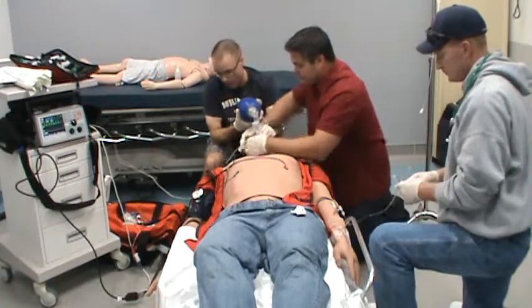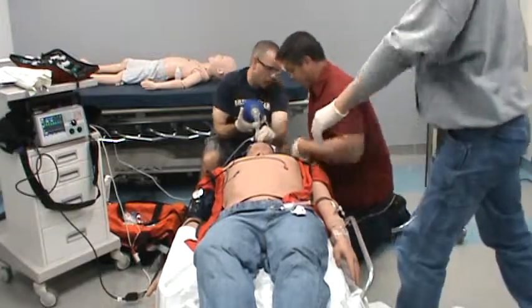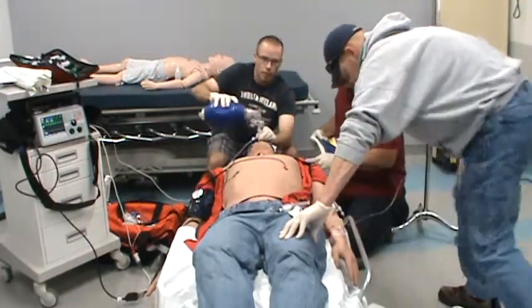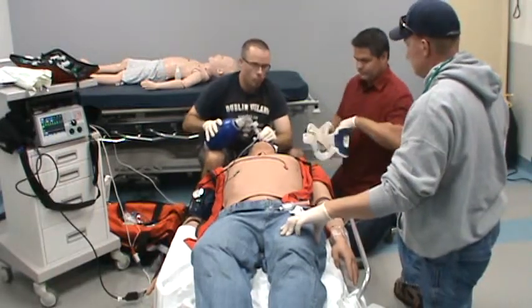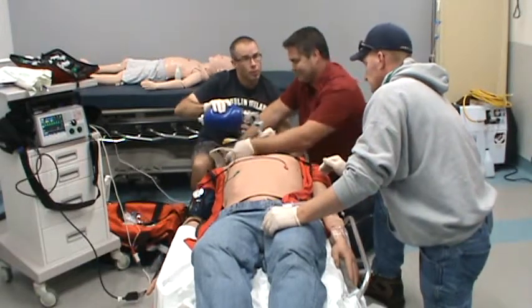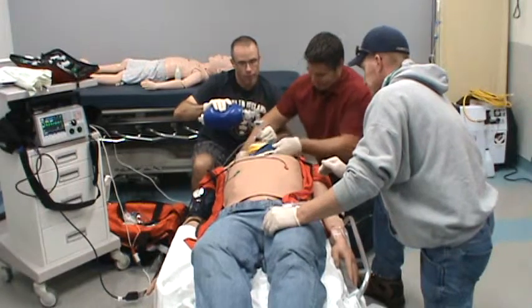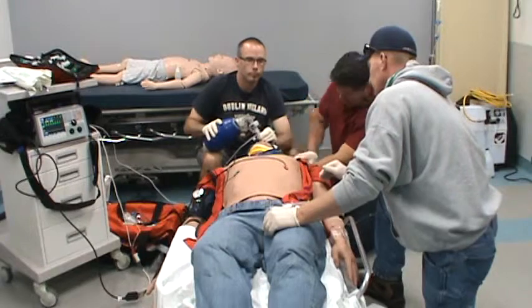Okay, I have a C-collar over here. It's right underneath there for you. Let's go ahead and secure them with that. Once that C-collar is secured, Rob, I'm going to have you re-listen to the lung sounds just to make sure we're still in the correct spot, since we've been moving them around a little bit.